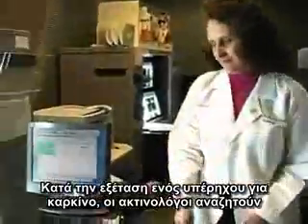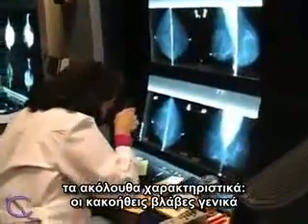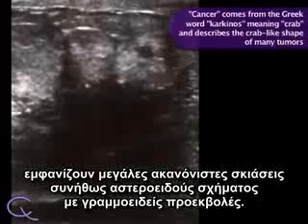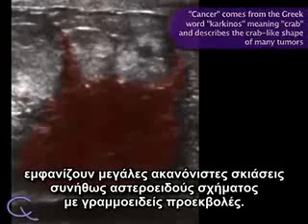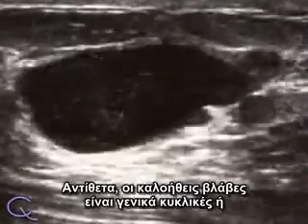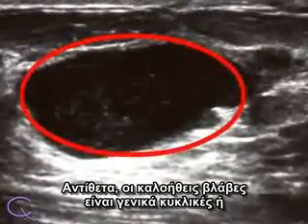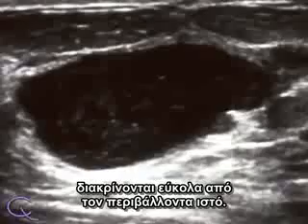When examining an ultrasound image for cancer, radiologists look for the following characteristics. Malignant lesions generally have irregular, vague borders and are often star-shaped with spiked finger-like projections. Other features include enlarged ducts or unusual tissue structures. On the other hand, benign lesions are generally round or oval-shaped and have well-defined borders that are easily distinguished from the surrounding tissue.